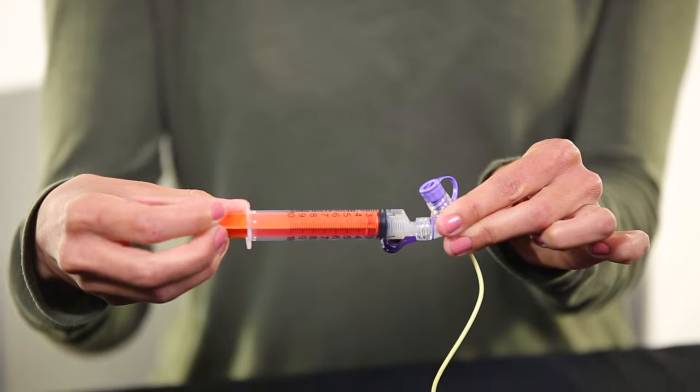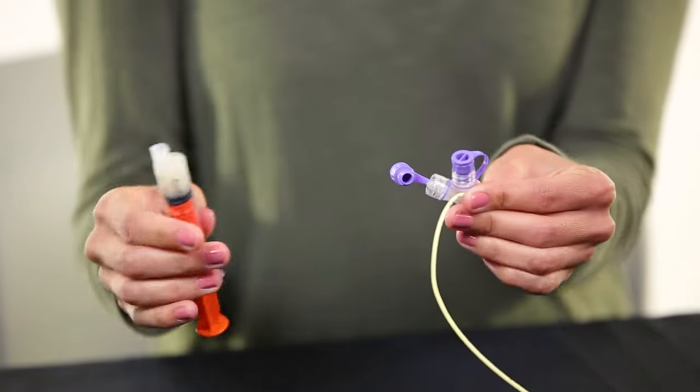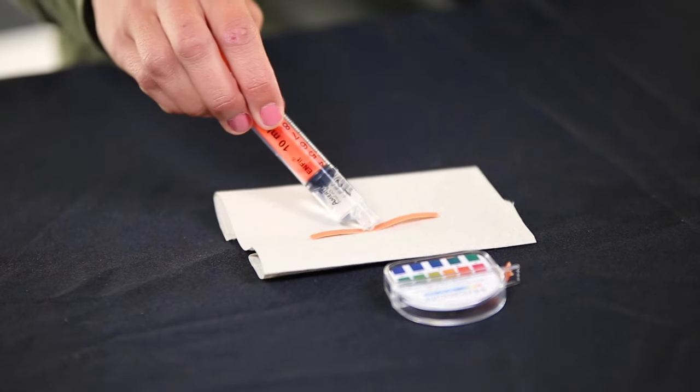Slowly pull back fluid from the tube. You should get a little bit of fluid called stomach contents. Clamp the NG tube and remove the syringe.